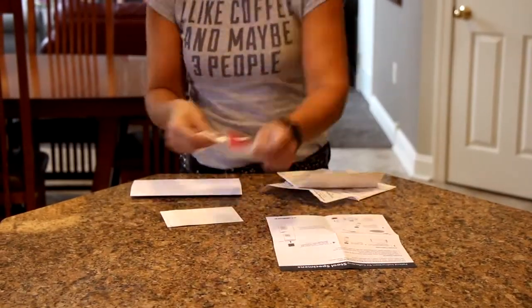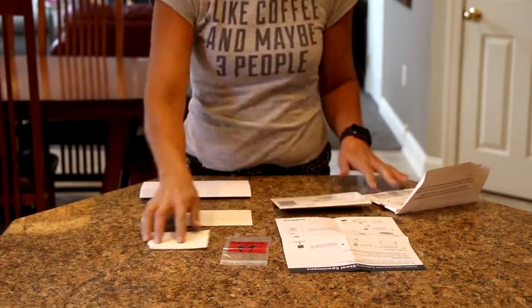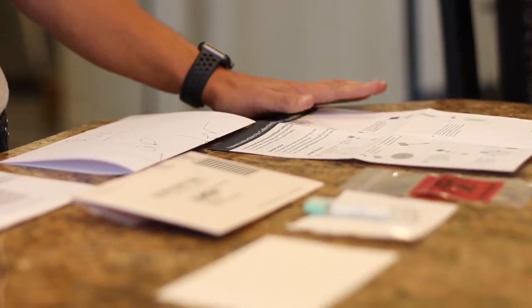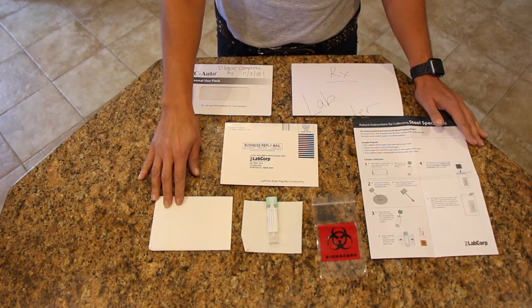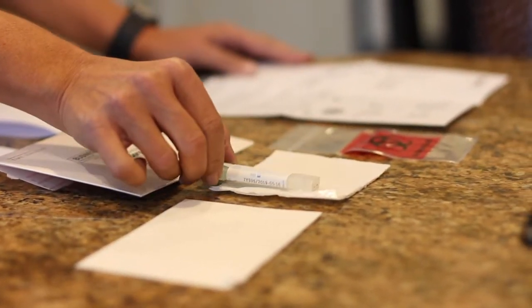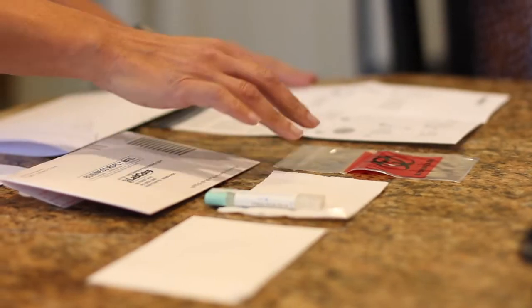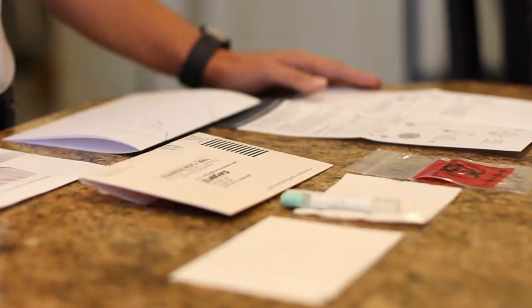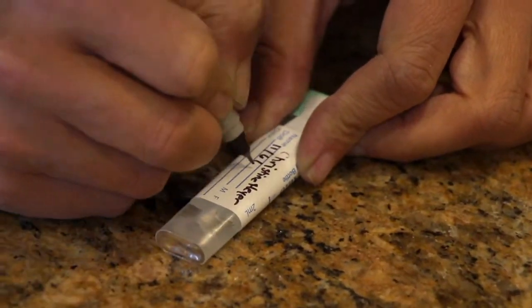I'm holding in my hand the humble FIT test. Everything you need is in this envelope: your lab order, a simple instruction sheet, your tissue paper which will lay on the toilet, your cartridge for collecting the sample, an absorbent towel and a biohazard bag, and then the envelope that you're going to send the specimen back in. That's it. Okay guys, let's poop.